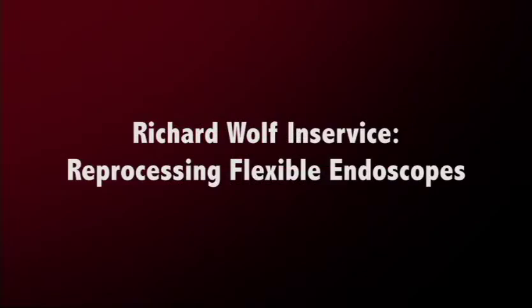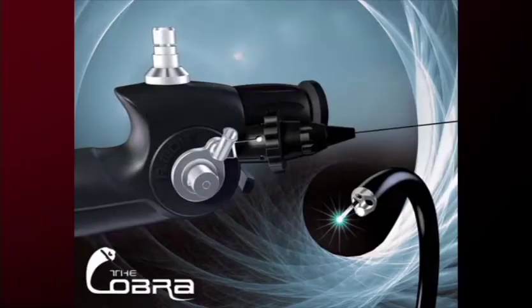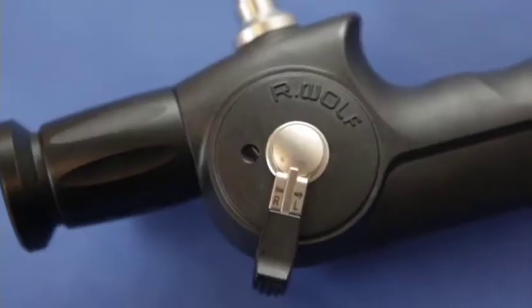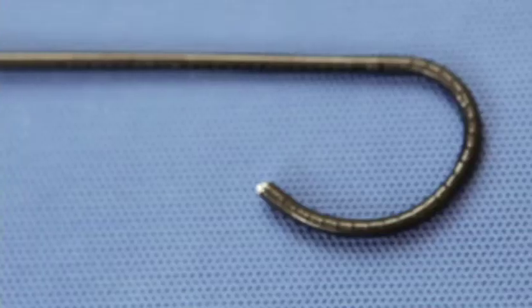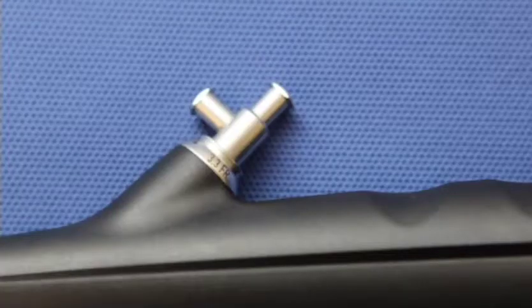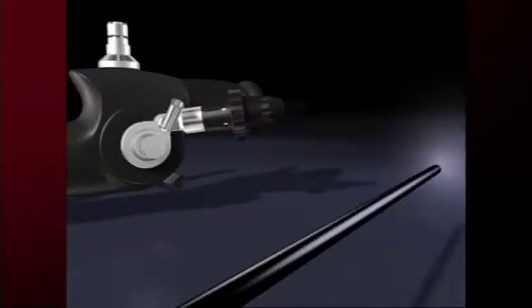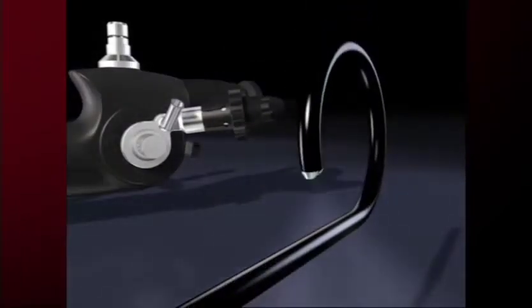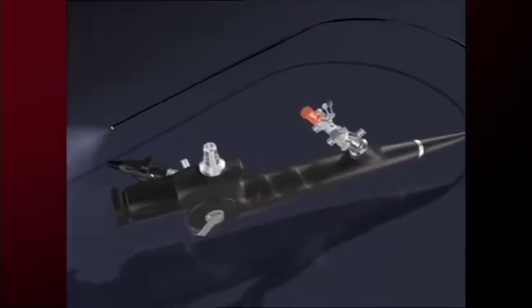Richard Wolff flexible endoscopes are small masterpieces of precision engineering. Richard Wolff manufactures two basic models of flexible endoscopes: a single channel and a dual channel endoscope. Both include a deflecting distal tip, a flexible shaft, an eyepiece, and additional ports and adapters. These instruments require specific care, handling, and reprocessing procedures to ensure they are always ready for the next patient.